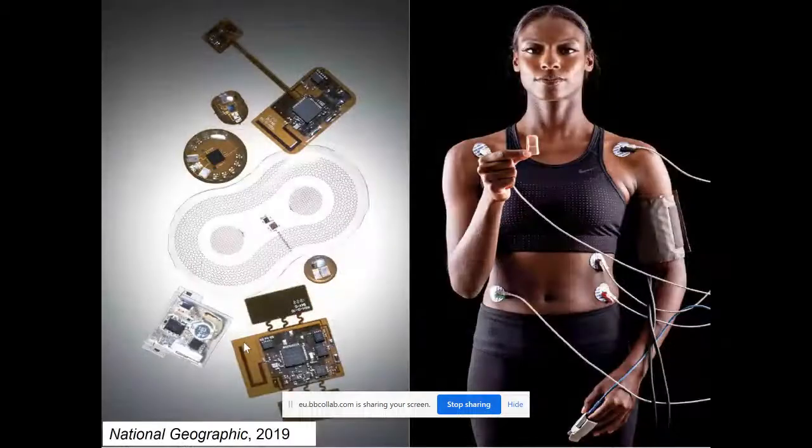And you want to move beyond that to devices that look like skin, in terms of their physical properties, so that they can interface with the epidermis almost as a second skin, but fully instrumented with advanced electronics, biosensors, radio frequency communication capabilities, and in some cases wireless power harvesting functionality as well. And we've been working in this space for a very long time, almost 15 years. And at this point, we have a toolbox of all kinds of different sensors and radios and energy harvesting systems and on and on. I won't get into all the details, just to give you a couple of examples.